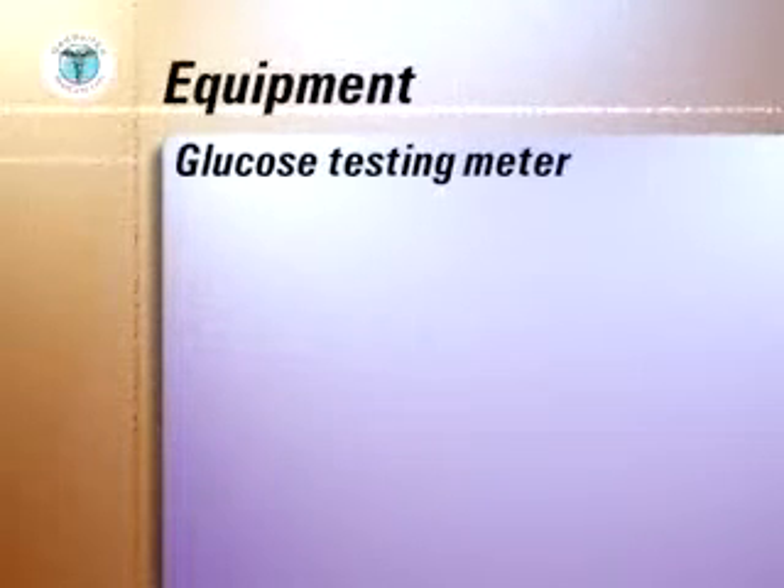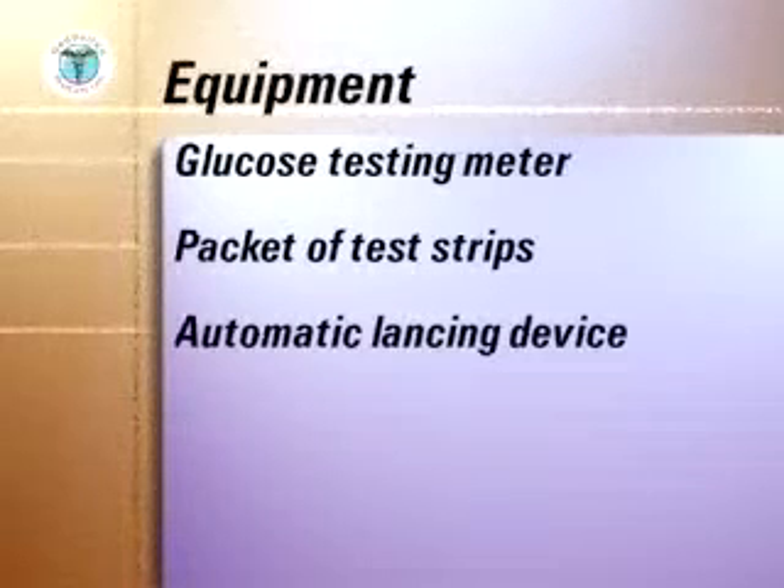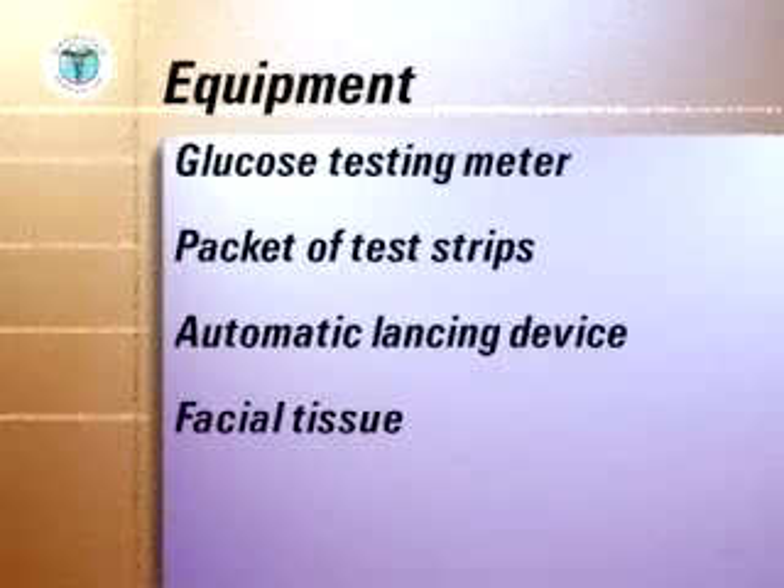The equipment you will need to assemble includes the glucose testing meter, a packet of test strips, an automatic lancing device and facial tissue.